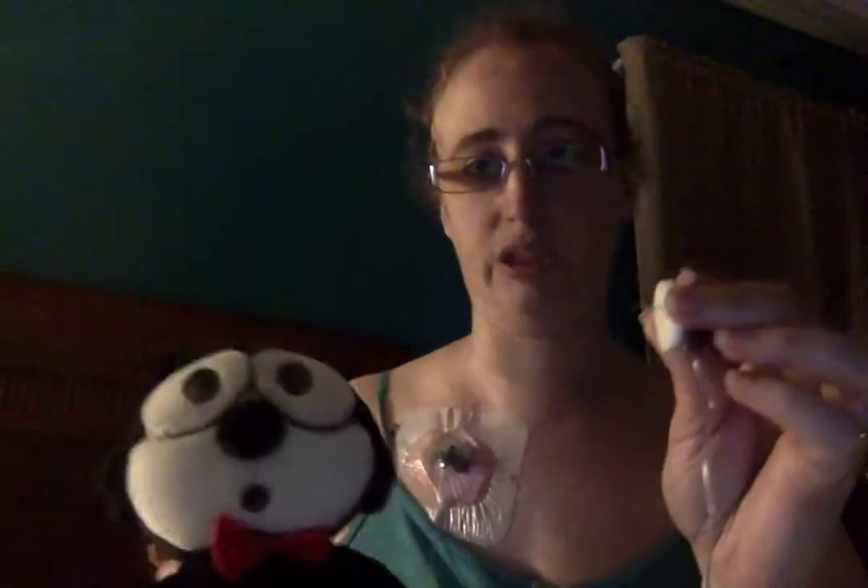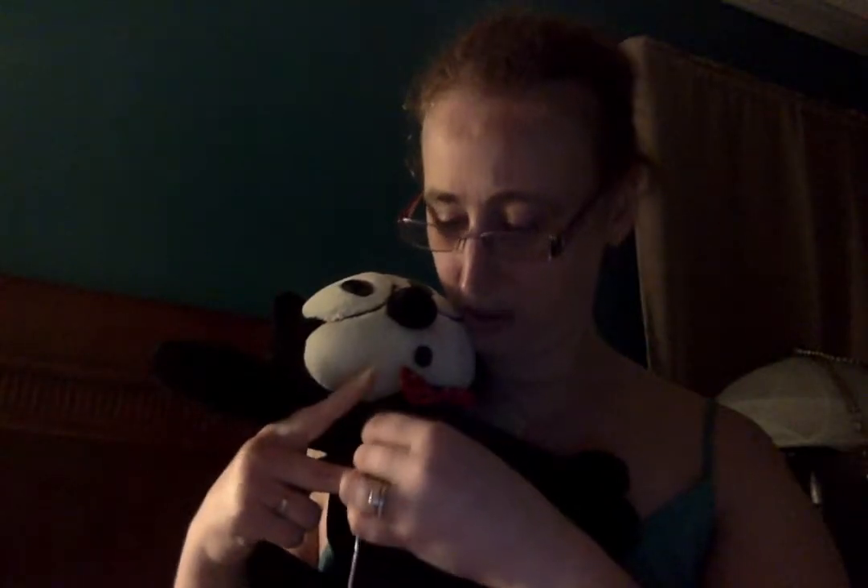So we're gonna hold our safety wings — we're gonna pretend like Felix has a port — we're gonna stabilize his port, put him on, and flatten out our wings that way. Perfectly acceptable, no problem. Obviously if we were doing this on a patient, we would be using gloves, sterile technique, all that other good stuff.